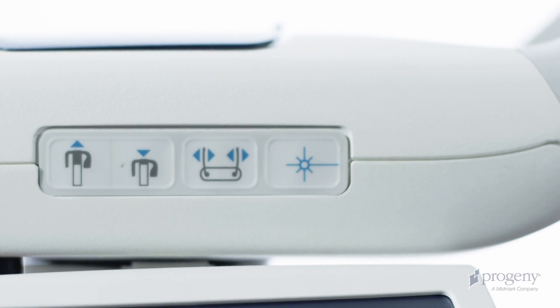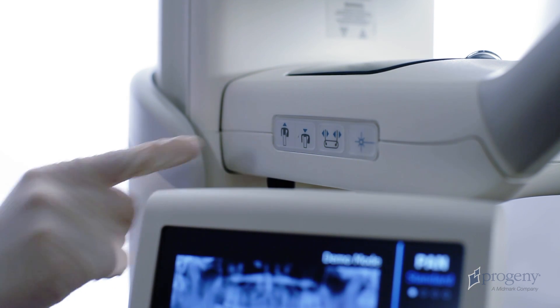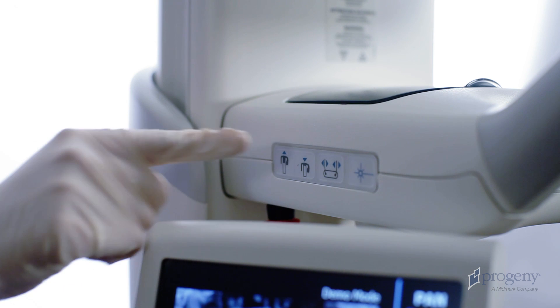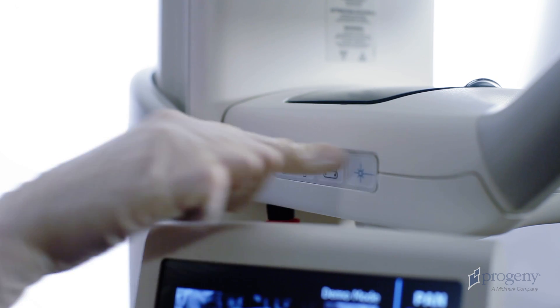On both sides of the positioning table, we have the control keypad, column height adjustments, temple wands control, and the alignment lasers.